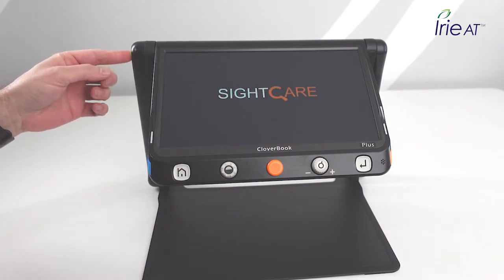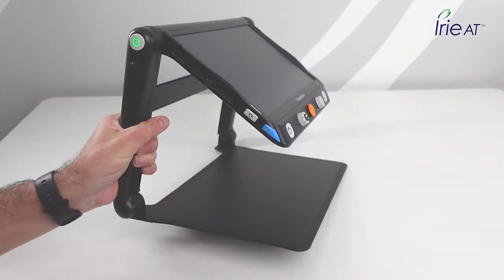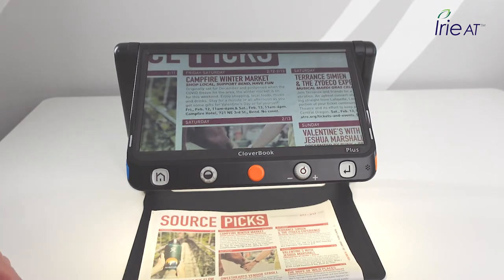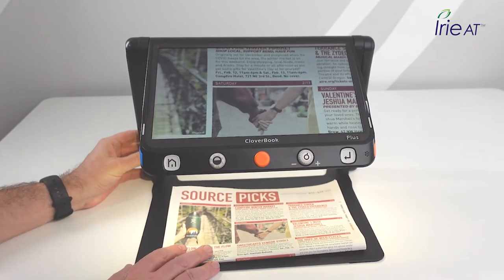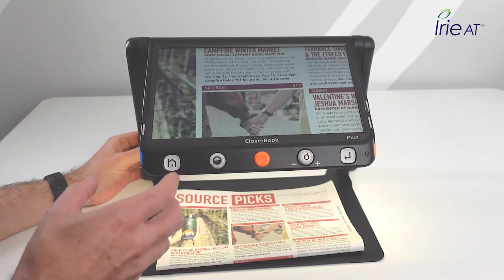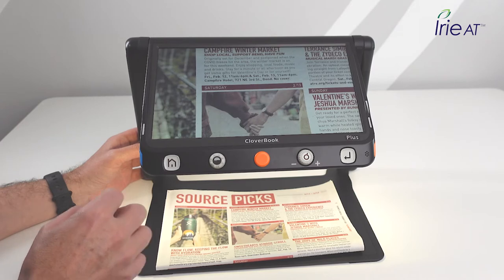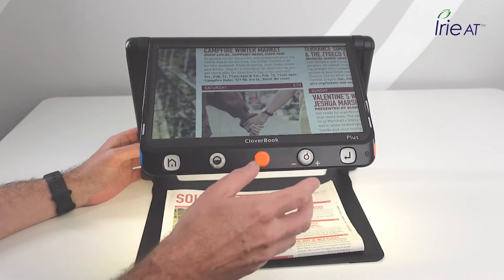To turn it on, press the power button on the left-hand top of the arm — it turns green when on. The LED lights underneath come on and it makes a happy power-on sound. Put some reading material in there right away and you can see it does what a magnifier should do — gives a really nice picture. It has a 4K camera under there and a full HD matte screen, which cuts down on reflections for a nice clear image.